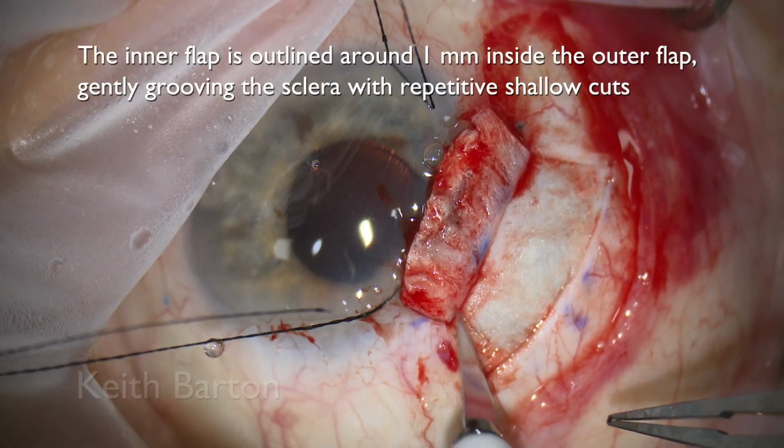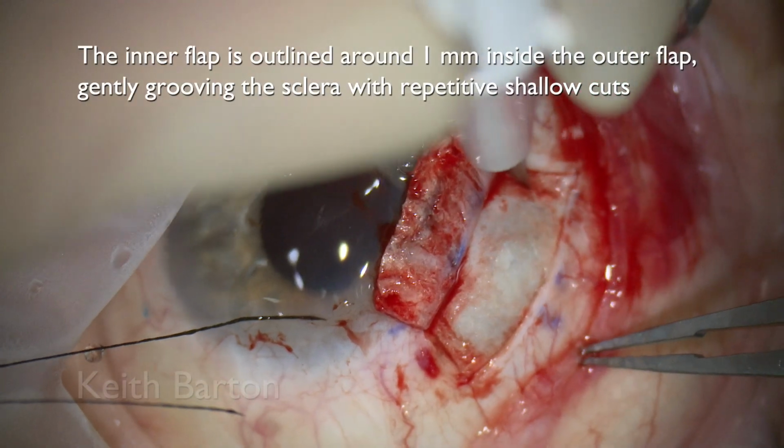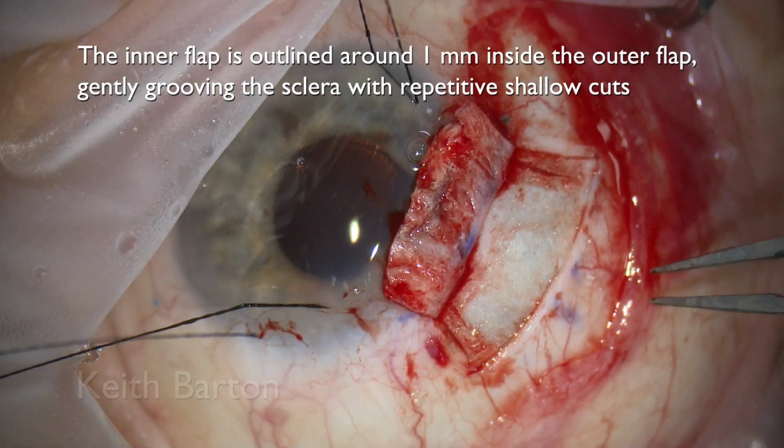The inner flap is then outlined around 1 mm inside the outer flap, gently grooving the sclera with repetitive shallow cuts.